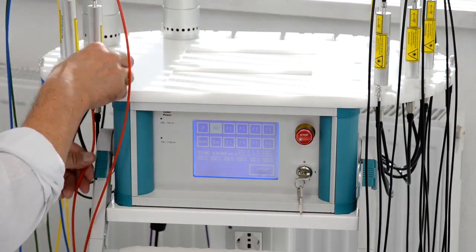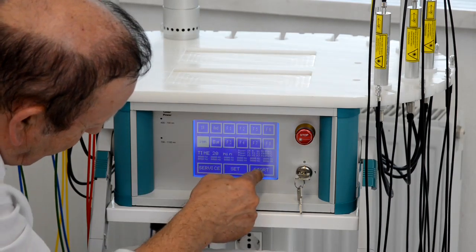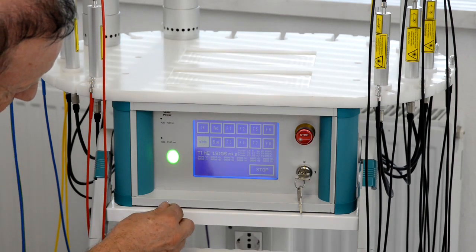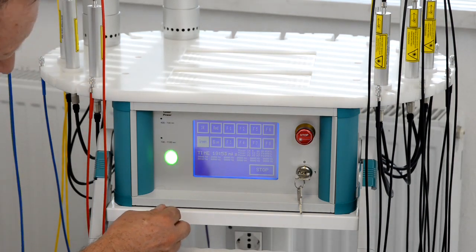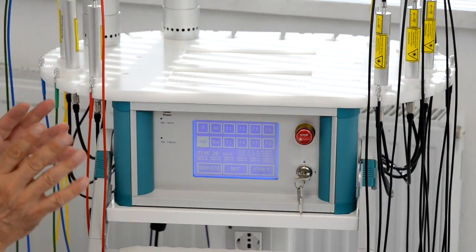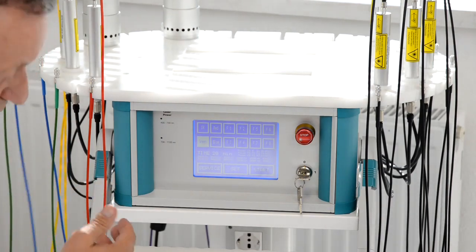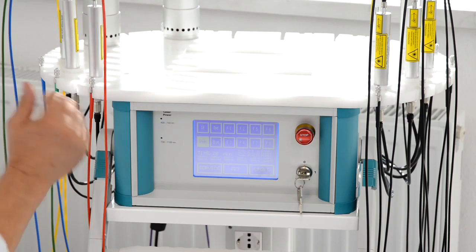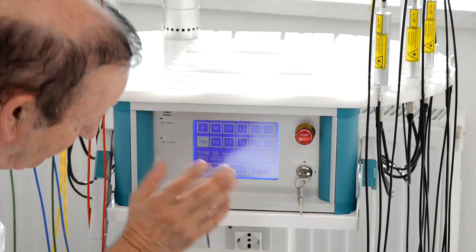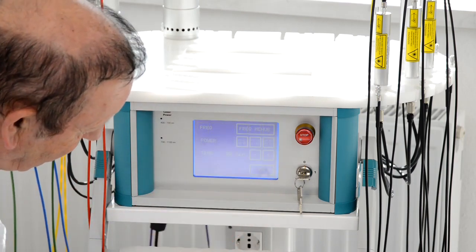Same the green one. I switch off. I go to the green one, start again, and now you can see the green laser working with 50%. So if I want to change the power now for the patient, maybe I want to use the full 5 milliwatt power, I have to change to 100%. And if I want to change anything on the device, I press set, and now I'm in the set mode.